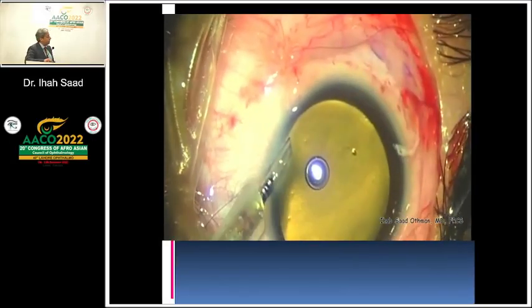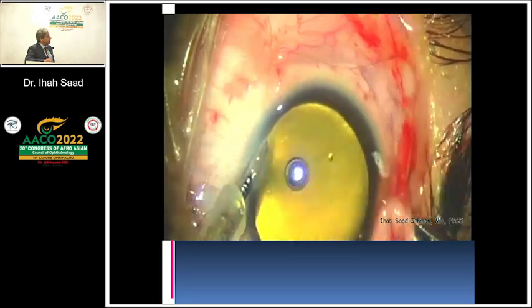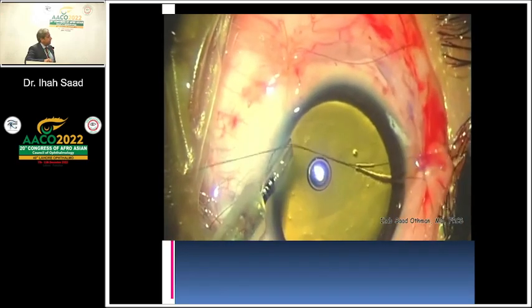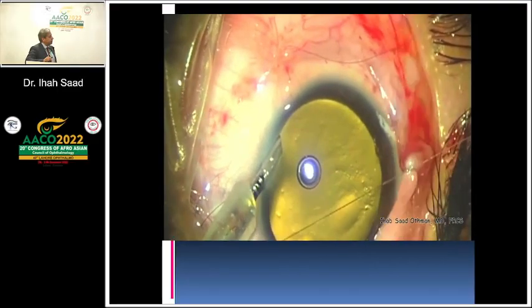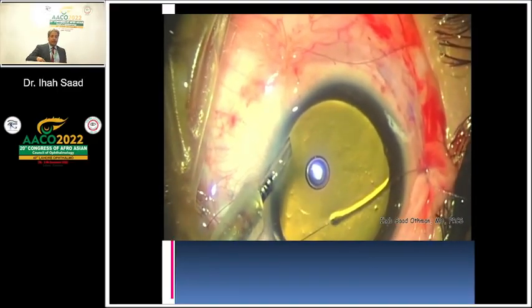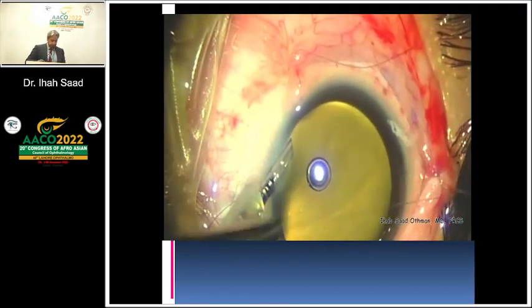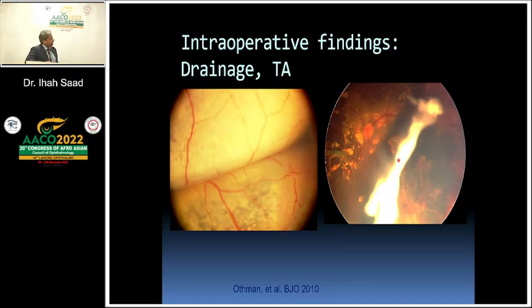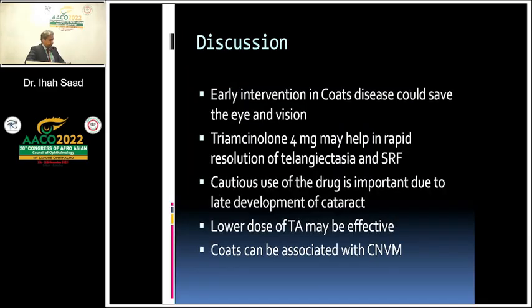There is no more retinal detachment. And we inject triamcinolone or any anti-VEGF at the time and leave the minimal remaining subretinal fluid to absorb over the next 2 to 3 weeks. Then do the peripheral laser ablation. And this is the intraoperative picture. Immediately after draining, you can appreciate the optic nerve, the triamcinolone, and the remainder minimal subretinal fluid cuff on the back.